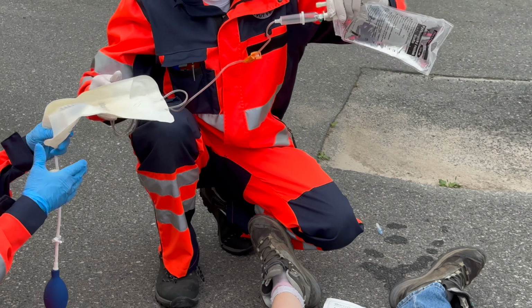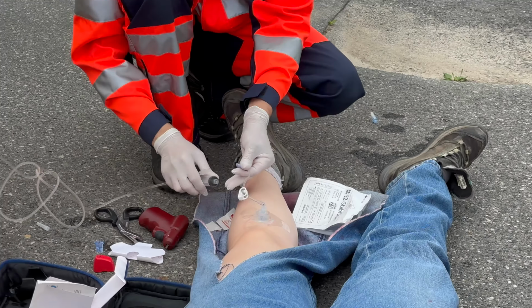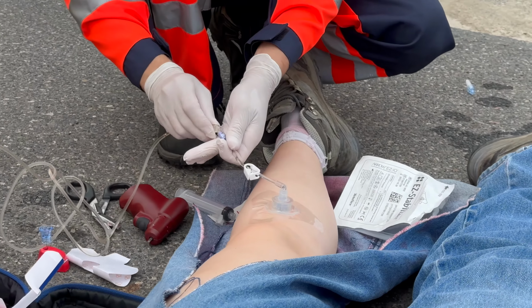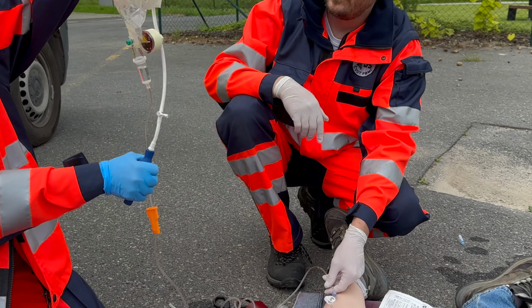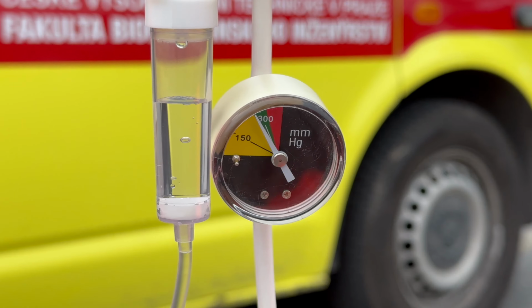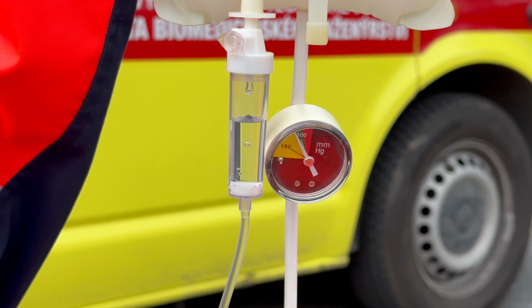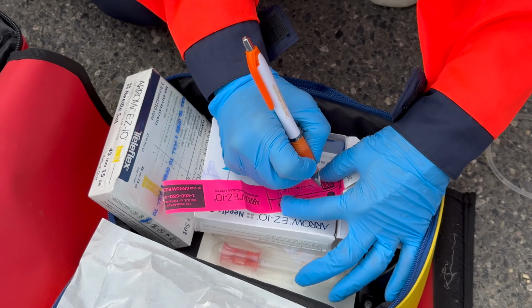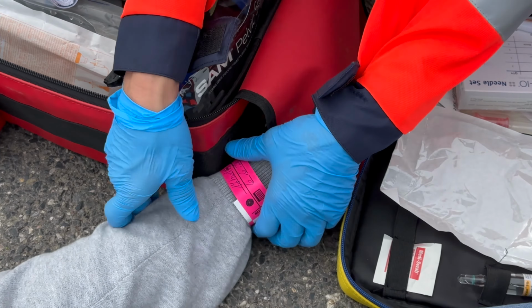The onset of action of medications via intraosseous access is comparable to central venous administration. The only difference is the increased pressure in the intraosseous space, which requires medications to be pushed into the circulation under higher pressure, for example, using a pressure infusion cuff for fluid therapy. All medications intended for intravenous administration can be given through intraosseous access without any difference in dosage. The intraosseous access site should be labeled with the date and time of insertion. It may remain in place for a maximum of 24 hours.